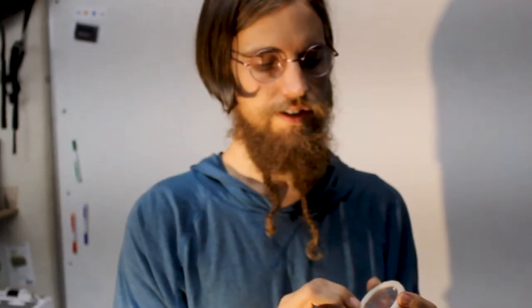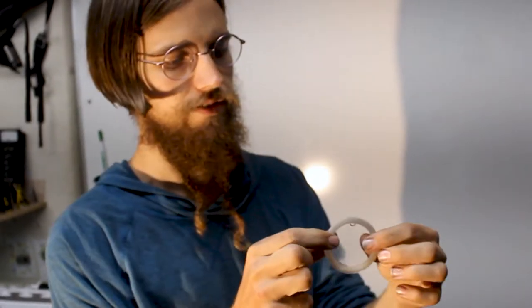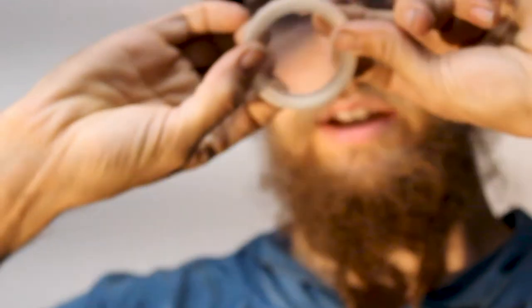So this is done in a few parts. I'm gonna go over those with you, but there's a few parts that make this two-sided, flexible, sealed membrane. And then this ring that presses and changes the focal length.